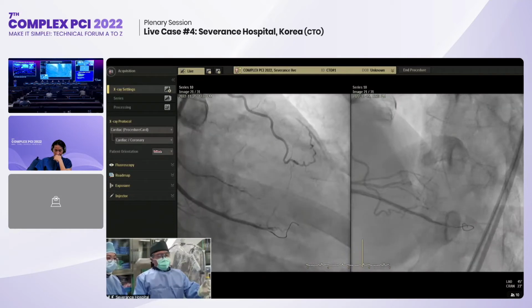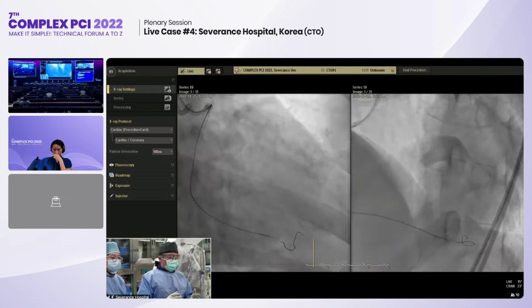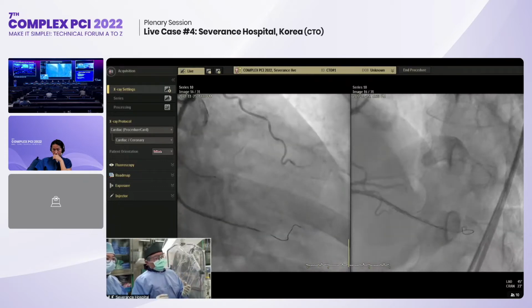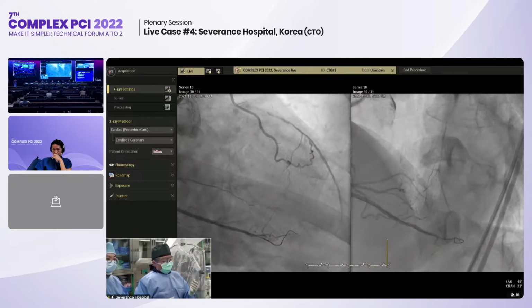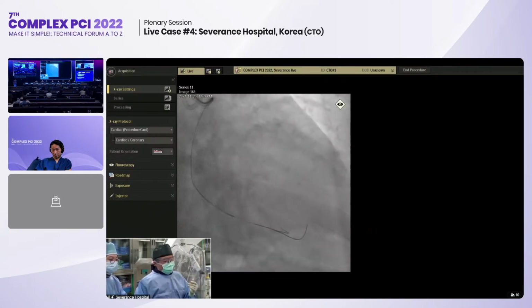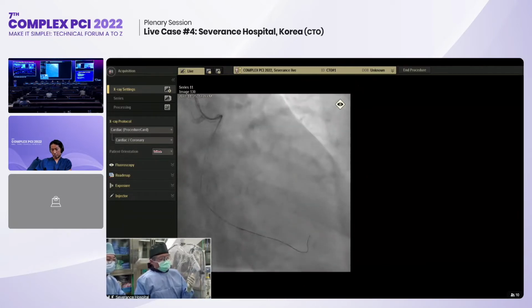So previously Habara mentioned that because of this kind of situation, we need some marker. Yeah, so based on this mark wire, and then using the Sasuke and also reintroducing the Corsair with a different wire. Next one. Yeah, this is the septal surfing like this. This definitely is some other branch, already occupied by different wires. This is the new wire. This is also shown, and then yeah.